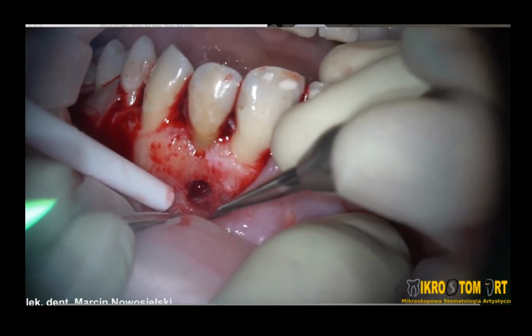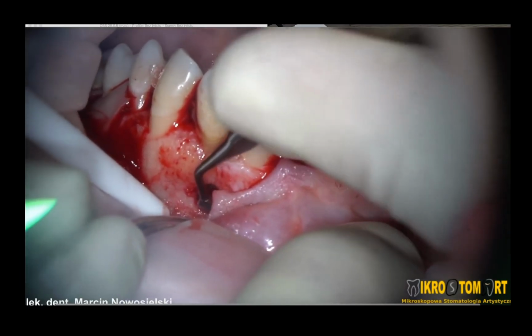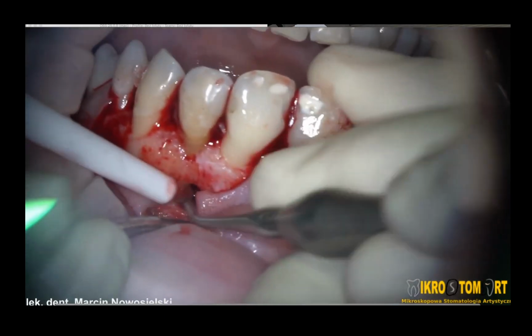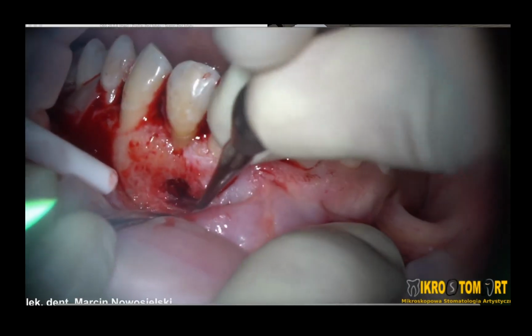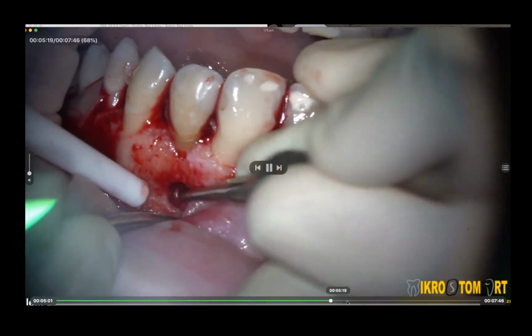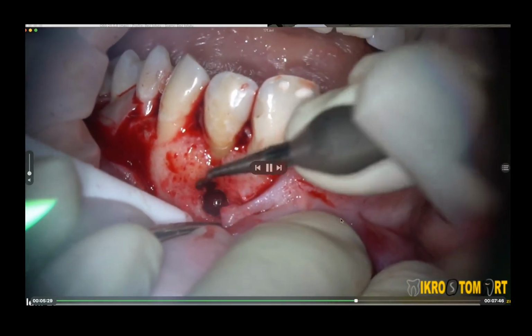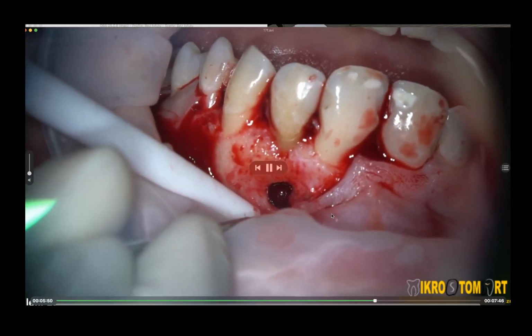And we will do it very fast, very effective, and with good visibility. So you can see I still try to do it. It is not so easy, and again, so let me just fast forward to the moment when I started to do it with laser. I think it will be now. Now again the spoon. Oh, yeah, here we go.